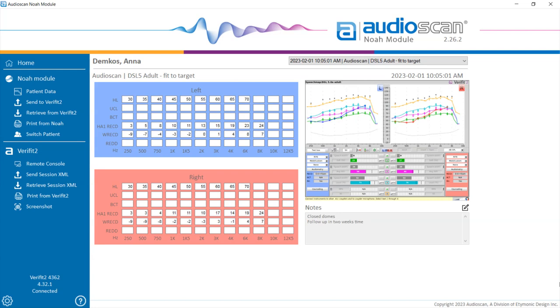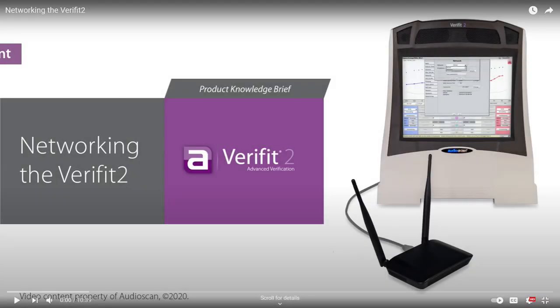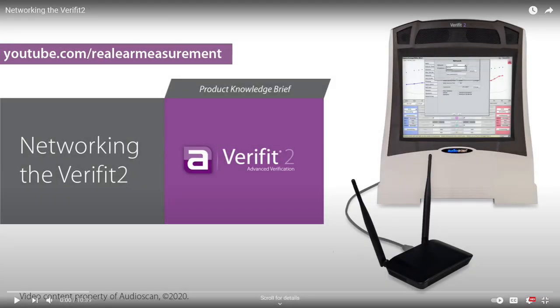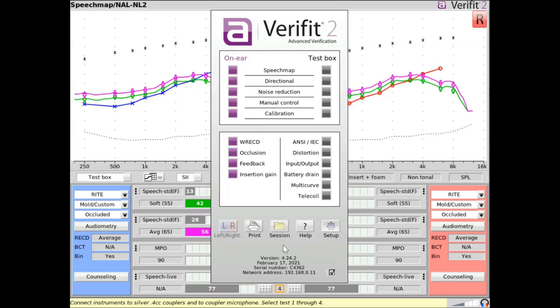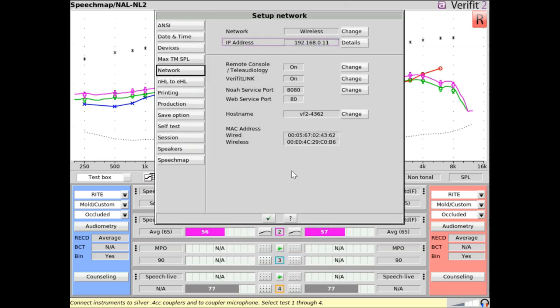Prior to using the Audioscan Noah module, the AudioScan equipment and PC must be connected to the same network. See our product user guide or our networking video for further information. Once connected to the network, the IP address should be noted, as it is used to allow the Audioscan Noah module to communicate with your system. This address is found on the main menu of your equipment or within the network menu within setup.